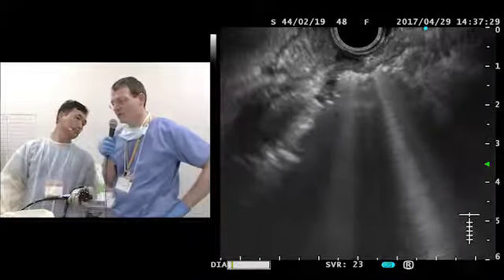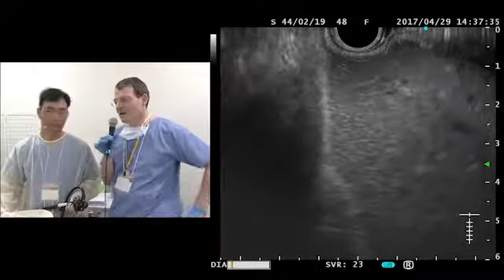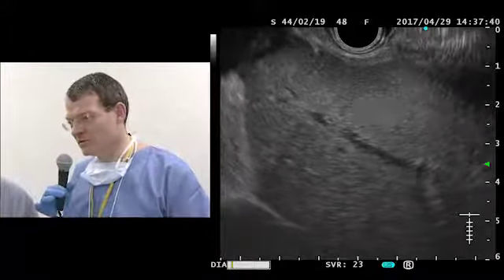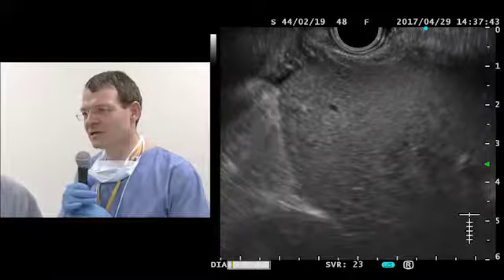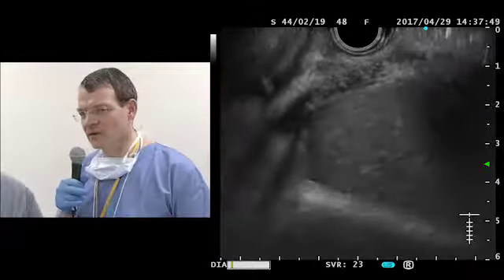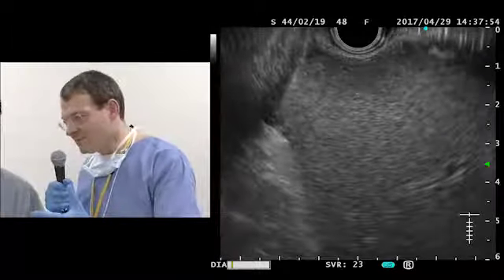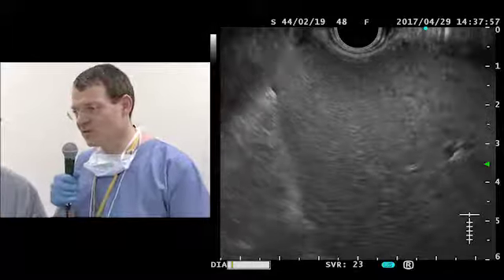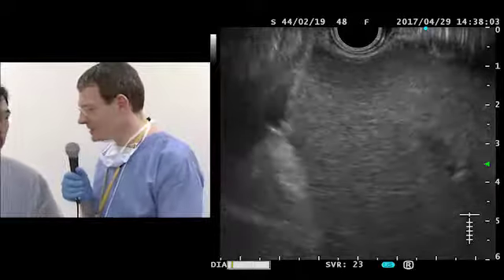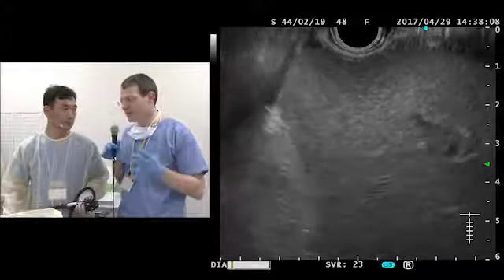Norio, you did very well, because this is a very tricky case, and somehow we are here in between the images, and it's also a good example of how important the history of the patient is. Already in your introduction you explained well the history and the laboratory results. We can learn from this case how you described the technique of EUS, the description of the lesion, the FNA, but we are not only doing EUS, we also have to focus everything on the patient's history and then try to make a diagnosis.